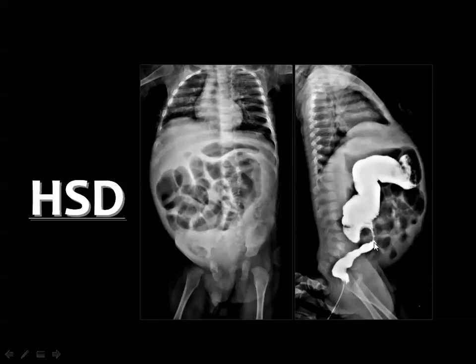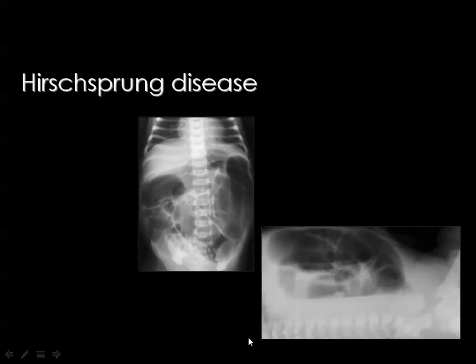Then you may aggravate the patient's condition and complicate the status of the patient. This is the rectum, and this is the narrowed segment. This is the sigmoid, which is distended. Then you stop here, not to continue to fill the colon with barium. This is a sort of intestinal obstruction, including the colon and the small bowel.